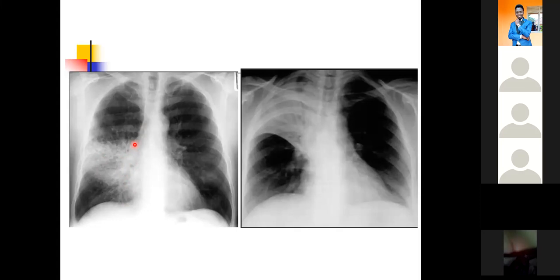Okay. The silhouette sign is now present because the contrast of this lung opacity is similar to the contrast of the structures within the mediastinum. So there is a silhouette sign. This opacity has a silhouette sign with the right heart border, as we can see there. Turning to this other image on the right, yes, of course, you can already appreciate that.